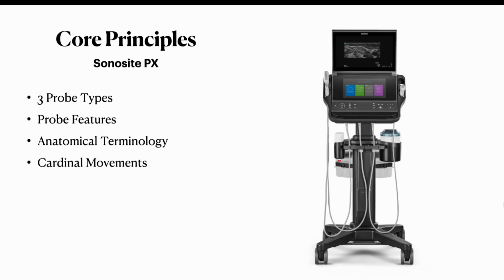We will briefly cover the 3 main probe types, go over the probe features that you will be required to know to perform this procedure, review some basic anatomical terminology, and finally go over the cardinal movements that you will need to know when attempting IV access with the ultrasound.